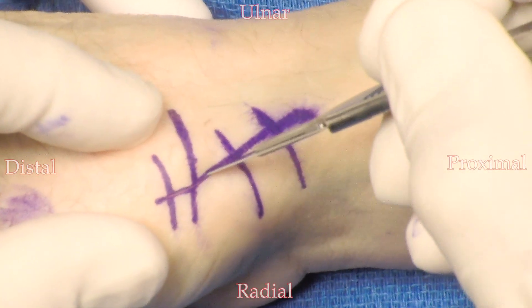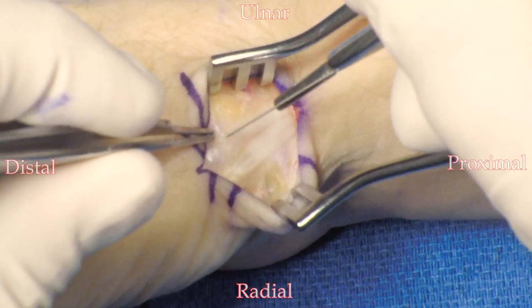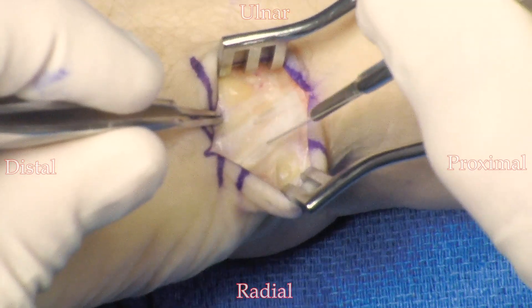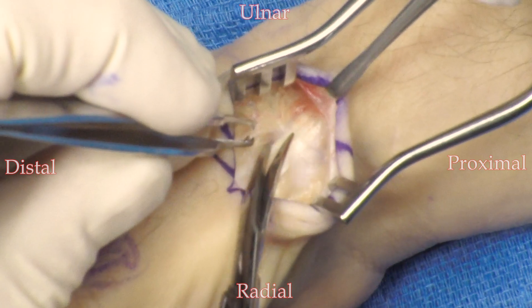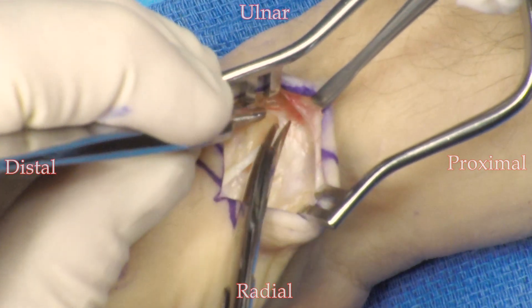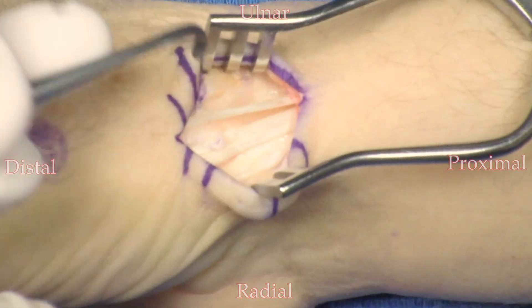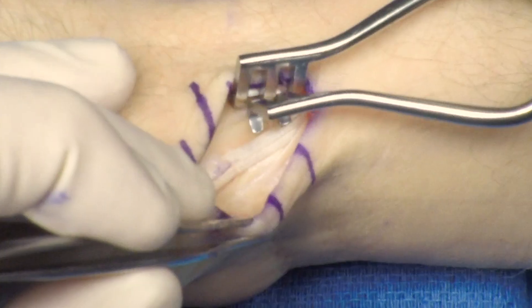The incision is made. The dissection is then taken down to the abductor pollicis longus and the extensor pollicis brevis tendons. Tendon sheaths are entered and released both proximally and distally. The retractor is replaced deep between the two tendons.